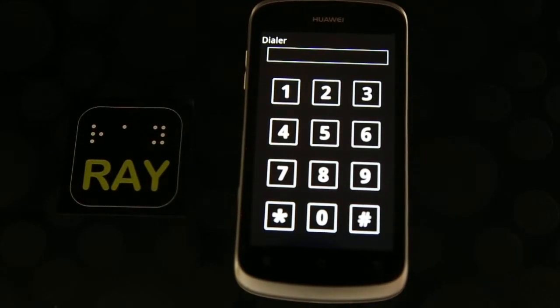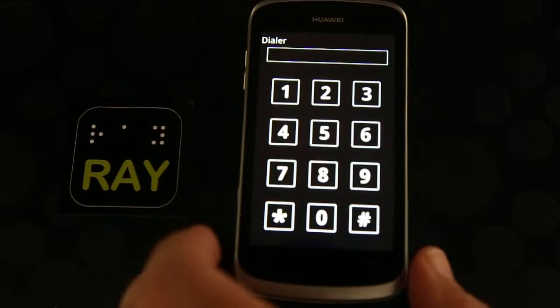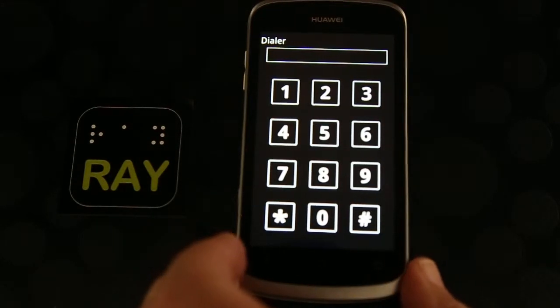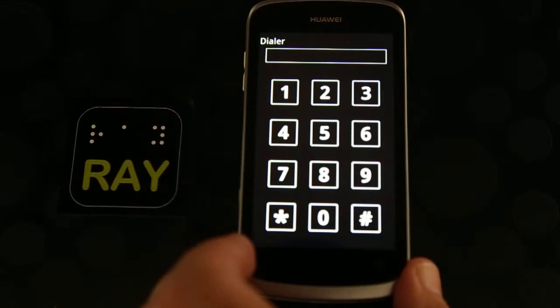Welcome to the interactive guide of Ray System. In this guide, you will learn and train the effective use of the system and the Ray device.